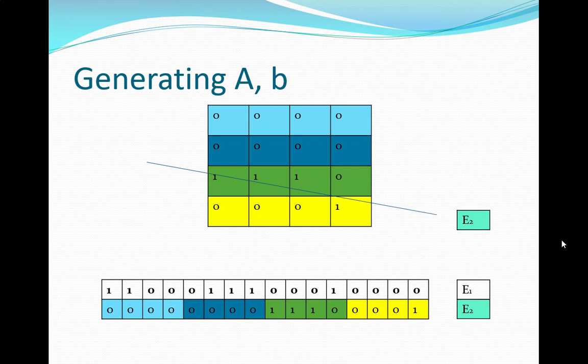A times X equals B. X is what you're going to solve for in software. How do you get the A and how do you get the B? You only measure this one directly. This comes from that scintillator at the end. These paths come from the entry and exit positions, and then we have to calculate them. When you do the path calculation, yeah.